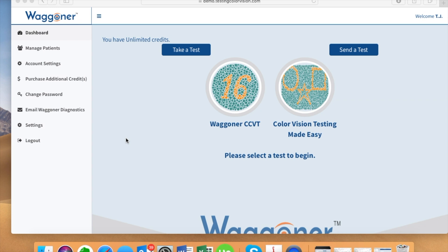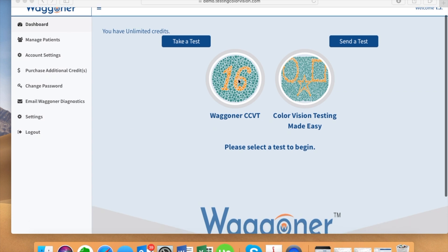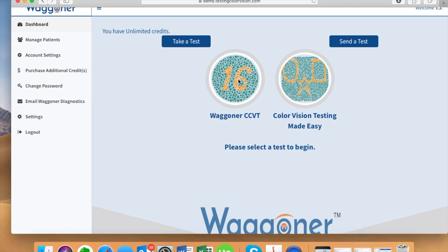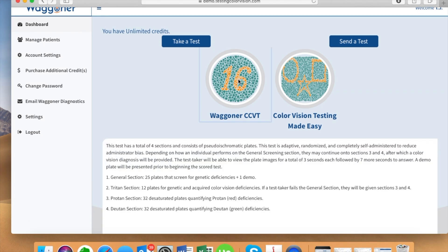Hi, my name is TJ Wagner and today I'm going to show you how to take an online ColorVision test via testingcolorvision.com, provided by Wagner Diagnostics.